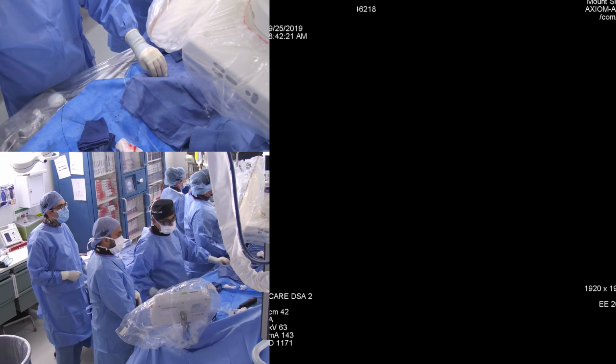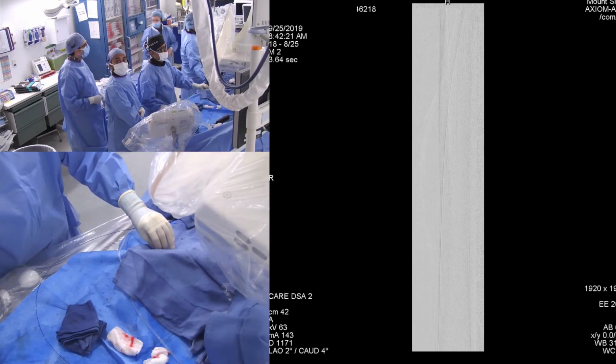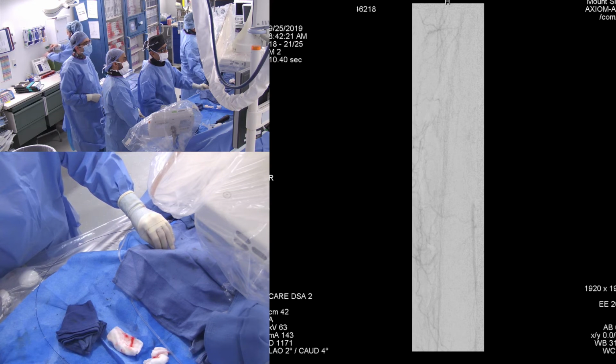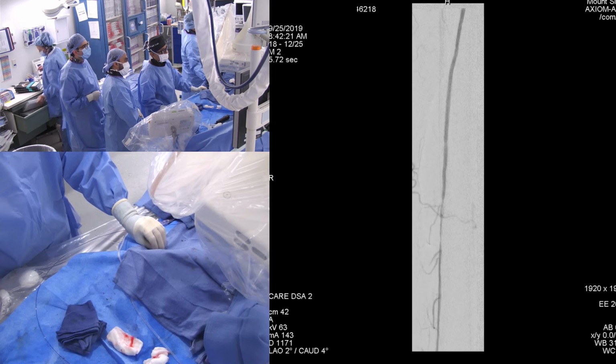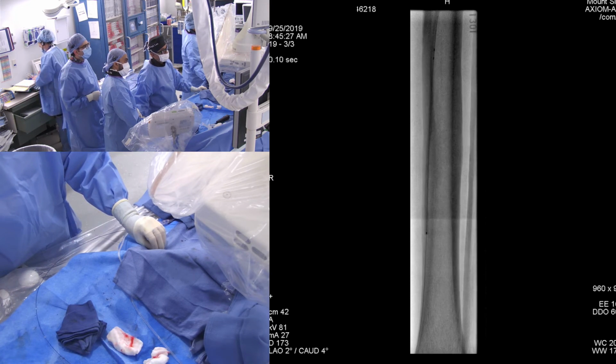But I want you to notice, and I know you do this, and we talked about it, see how we ended the balloon angioplasty, and you can see there's a diseased segment that we didn't touch, because that competitive collateral is kind of where it reconstituted. So I was very conservative taking my balloon all the way down because I didn't want to go into the healthy vessel. Now I identified that spot, and I ballooned with an appropriate size balloon of 2.5 at that level, left it up for another two minutes, and we didn't take a picture yet.